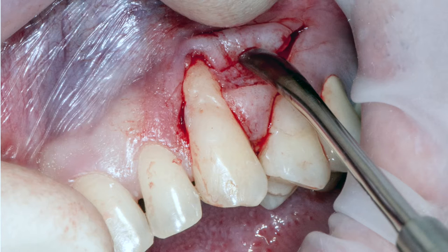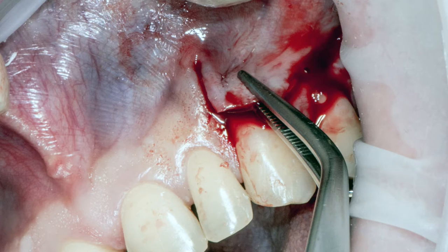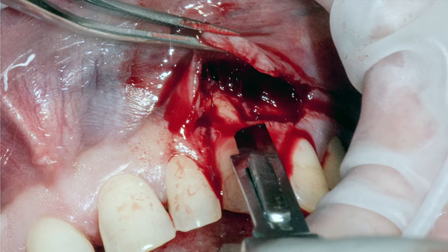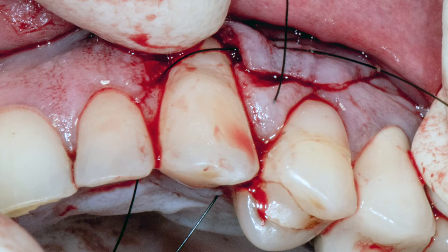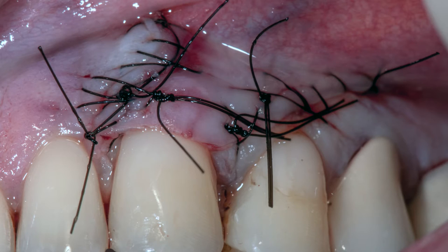Вот этот трапециевидный лоскут латерально начинает перемещаться в зону рецессии, производится дополнительная мобилизация и фиксация. Фиксация выполняется обвивным швом: прокалываете соседний сосочек. Так сложилась сама операция, что фактически донорской зоны не оказалось.